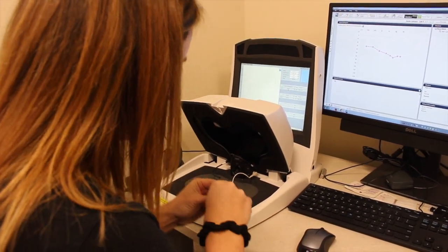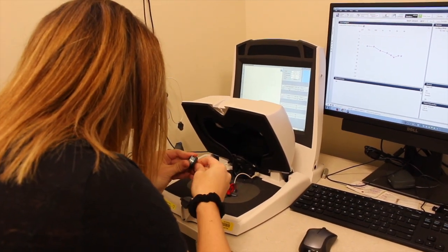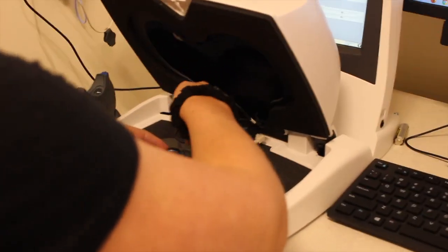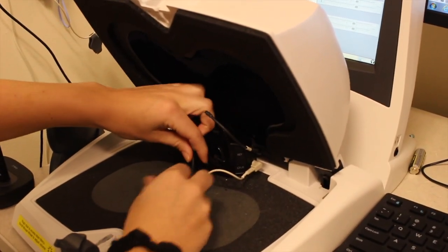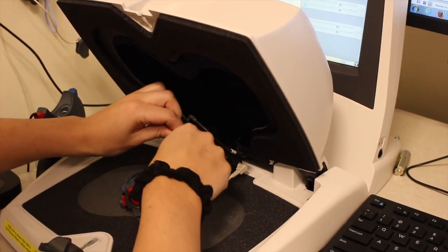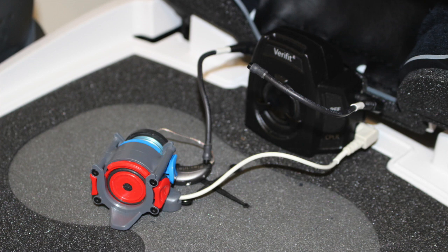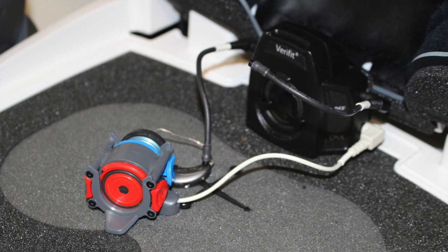There are 2 input signal options available. We selected the speech noise signal, where the front speaker output is speech and the jamming speaker output is noise. Through a structured alternating measurement paradigm, the aided output for front and back jamming speaker input signals can be measured and displayed independently. When these 2 output curves overlap, an omnidirectional condition is present. When these 2 curves separate, with the output for the back jamming signal less intense than the output for the front signal, a directional condition is present.